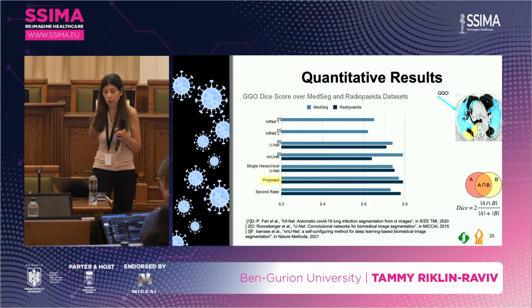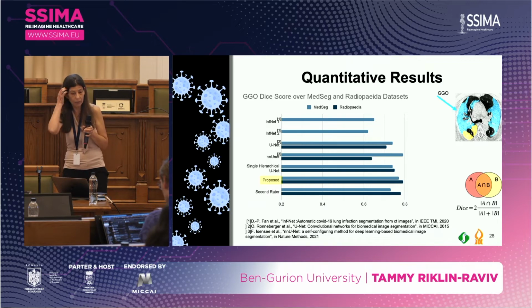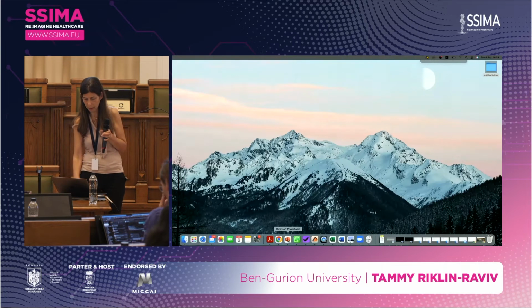Quantitative results related to the dice score. We compare ourselves to different algorithms, for example, the InfNet.